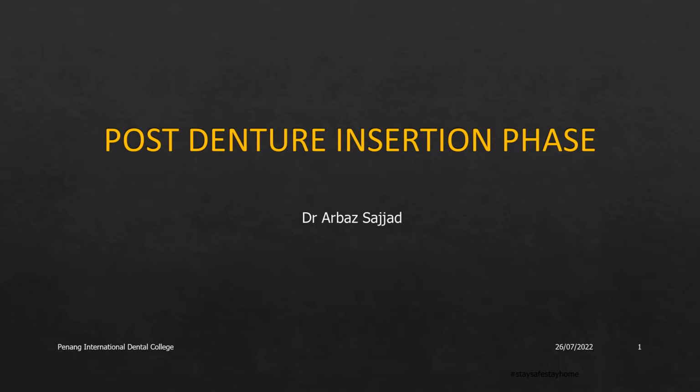In the last topic, we covered the denture insertion and what all steps to be followed during denture insertion. So the next step is the recall appointment or the review appointment, during which we check the effects of the denture and whether the patient has any specific complaints or any problems with the denture that can be corrected at this appointment, so that the patient can be more compliant towards wearing a complete denture.